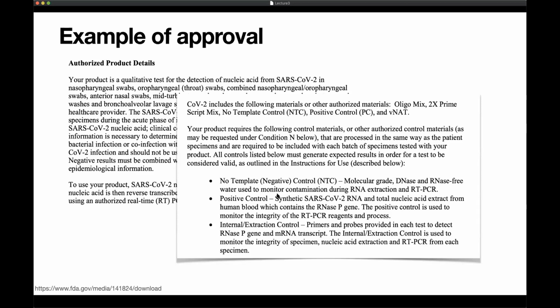And this is all very important because it significantly reduces the rate of errors of individual tests. And it specifies for each individual protocol which controls are provided and which ones are required. Right. So you can look at these documents if you're interested. Surprisingly, it's actually very difficult. If you get a test, you probably won't know which specific test you're being offered. But I think it is important to know because they're all very, very different.